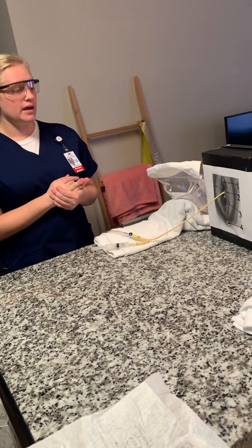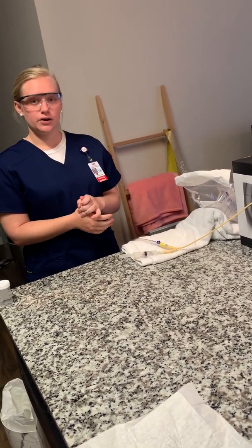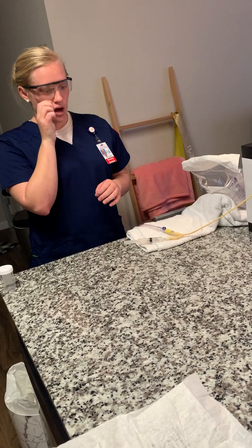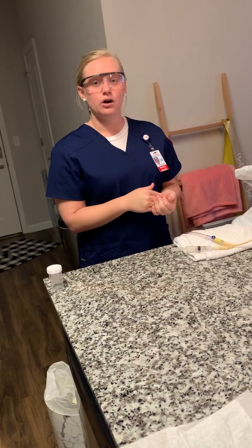I want to document the amount, the color and odor, and the consistency of the urine, how the patient tolerated the procedure, the intactness of the catheter tip, how much of the balloon drained, and then symptoms of a UTI, which would include things like fever, nausea, and vomiting. And I also want to note that I would come back and assess my patient after 4 to 6 hours to see if they're voiding or not. And if they're not voiding, I want to either palpate the bladder or get a bladder scan. Thank you, that's it.